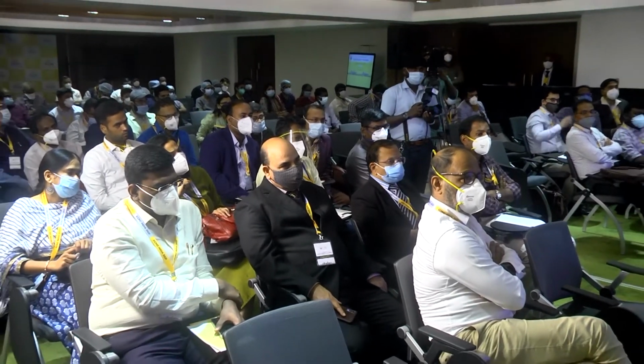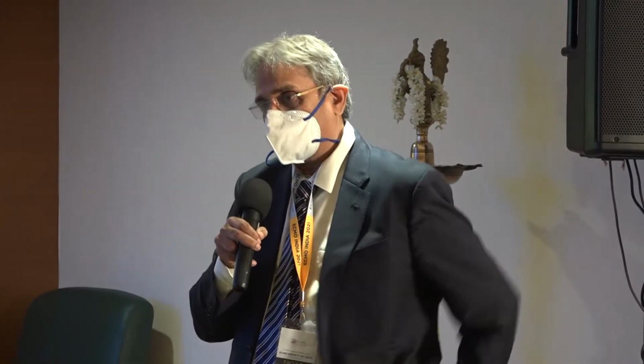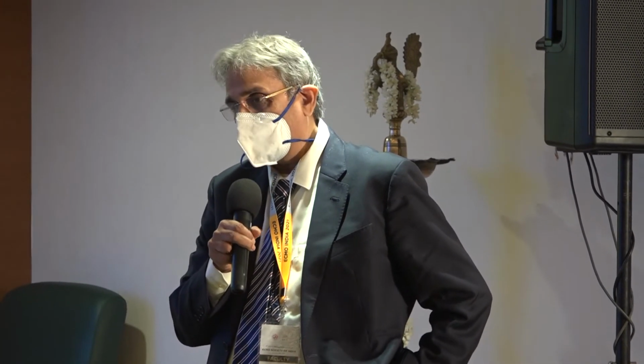See, as long as it's a VA ECMO, if you're planning to support on VA ECMO, you need a venous access. So even if it's a Fontan, either a groin or a neck, if the complete Fontan is good enough. The problem comes in small children, and if you have a 4-month-old child who has a cardiac arrest, it's not easy to do an ECPR, to massage and cannulate, and sometimes, as I said, 3 o'clock in the morning, it takes time to get help. Under those circumstances, we've actually done 2 patients where, in one of them I was the only one available at that time. It was 3 or 4 in the morning.